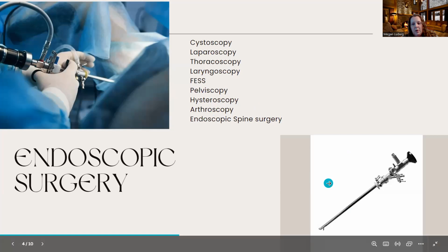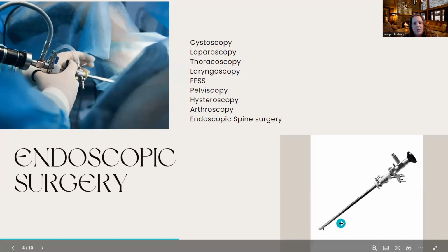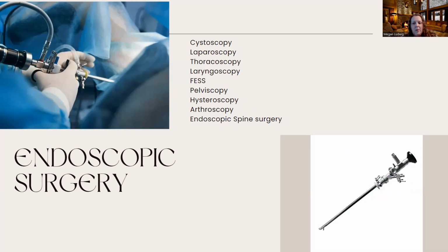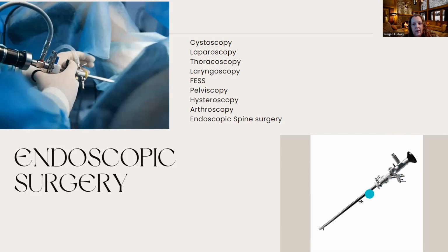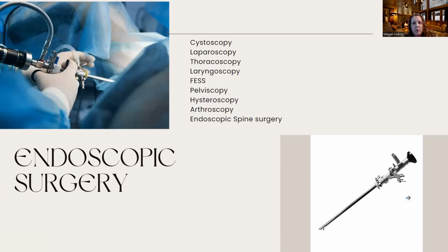So here's a type of cystoscope, could also actually be a hysteroscope, very similar setup, but notice the same type of scope part that I showed you on the previous page. It's got the light adapter. This part's for viewing at the end, the black part. Now this one also has what's called a bridge. So it connects to the sheath, the outer sheath, but it has ports for hooking up fluid.